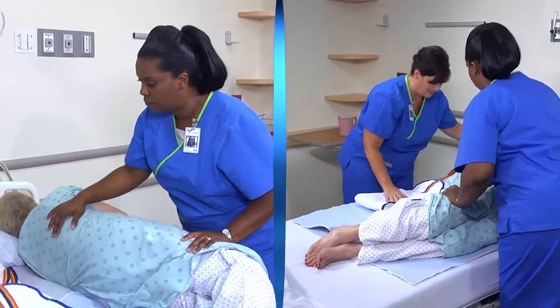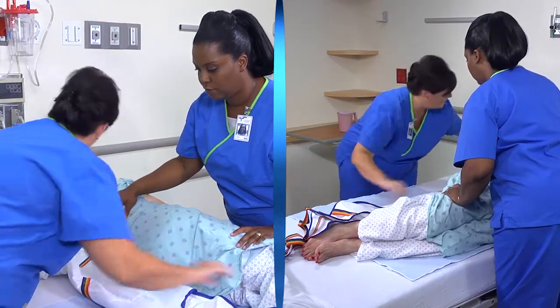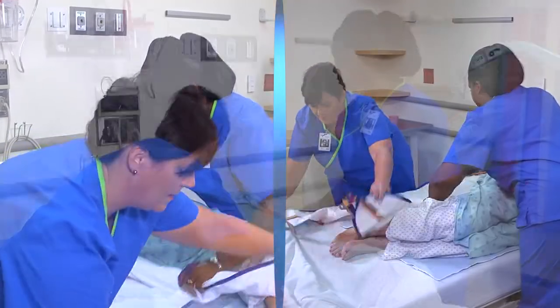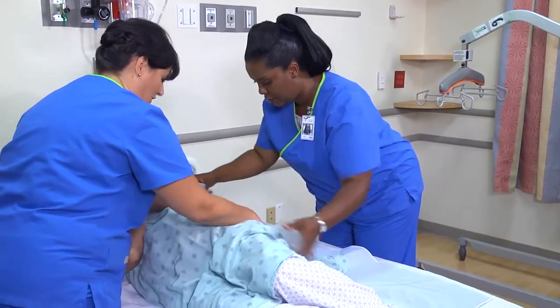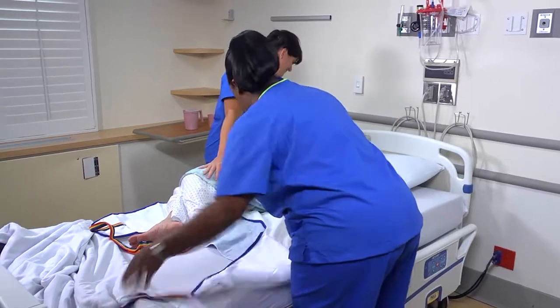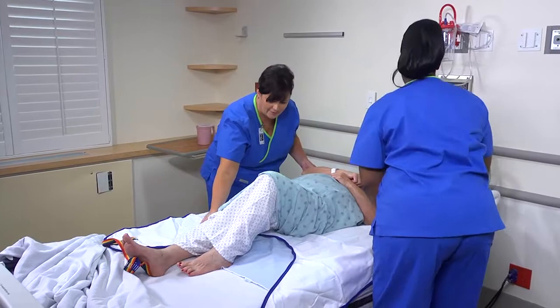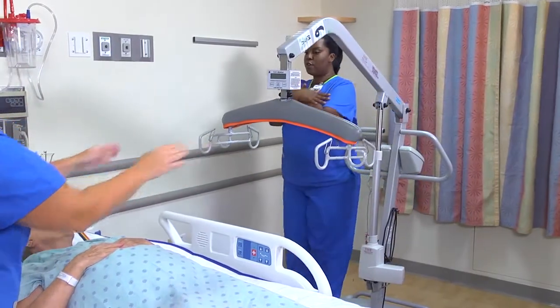Miss Wilder, let's roll on the other side towards Cindy. Roll the patient to position the sling beneath her, then roll her back onto her back. Ask the patient to cross her arms over her chest.